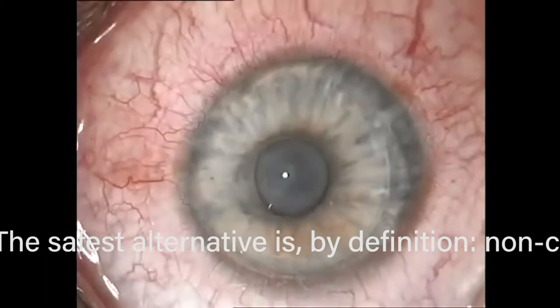Now it's just smoothing out the flap, trying to make it look nice and regular so you don't have any wrinkles, striae, or debris. And that's pretty much the case.